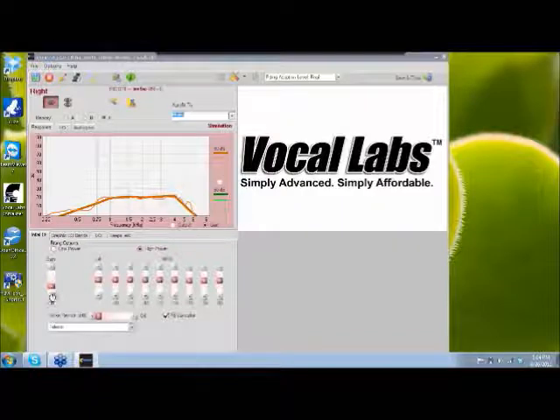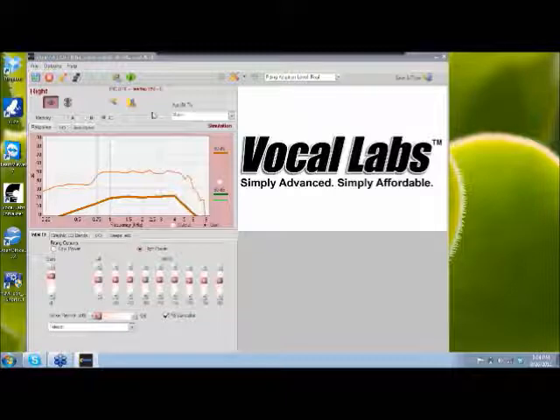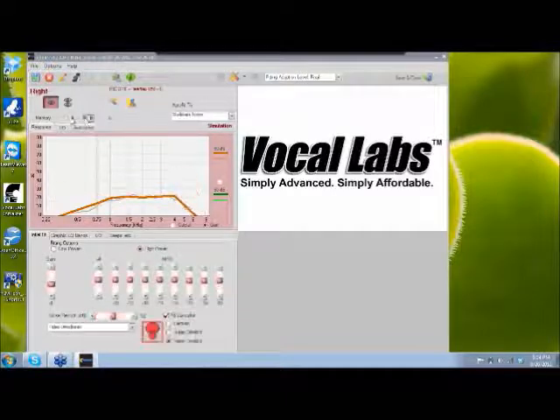And now when you do this, you may want to give them more overall gain, just depending on what the patient says about the volume on the phone. At this point, we have auto-fit and adjusted our inputs on every memory that we want to program. So what I would suggest doing, when you make changes to a device, they will hear the changes while you change it on the screen here.